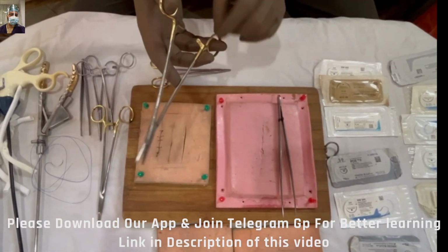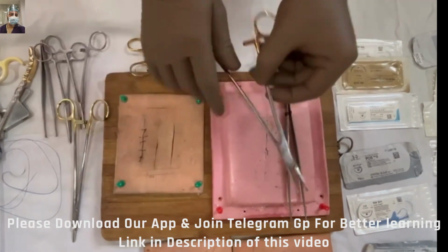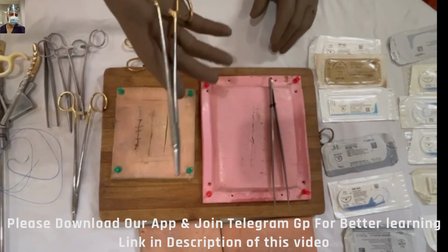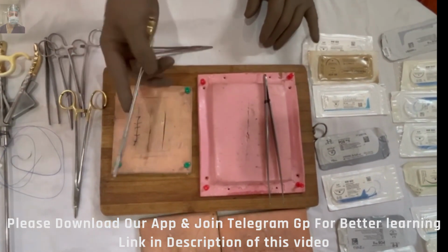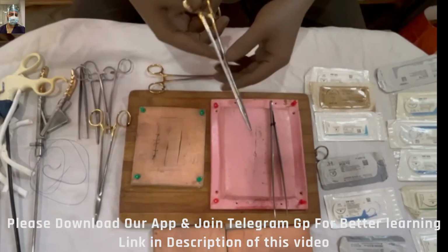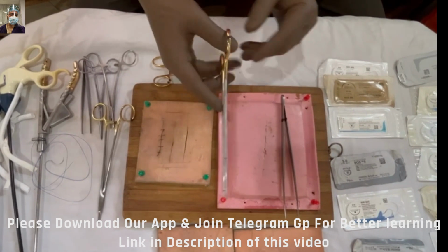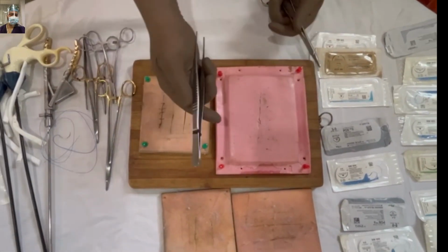Again, some of you have asked in the chat section on our app, and some commented on YouTube, about palmar technique versus finger technique. So palmar technique, I prefer, as I said in the first part, that this is my preferred technique because it gives a better dexterity. But you have to master both the techniques.